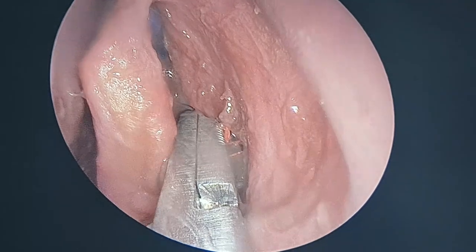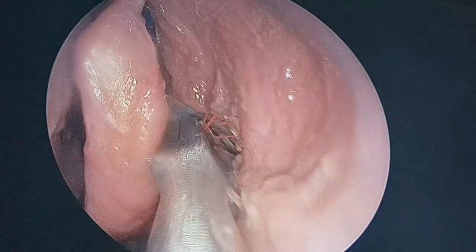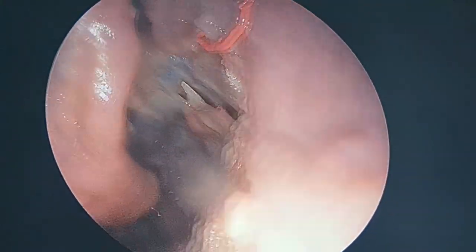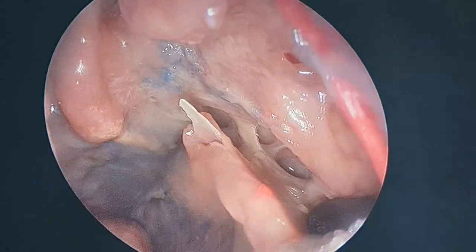See where anteriorly I have come? Close to the nasolacrimal duct. If you come across a very hard bone, stop. Otherwise, you can bite through the nasolacrimal duct, and that is something we do not want at this stage of the surgery.